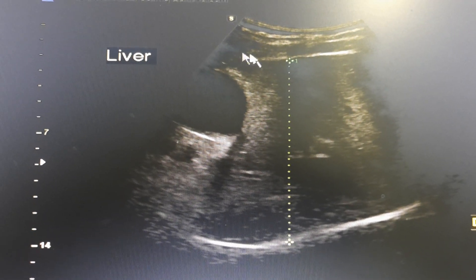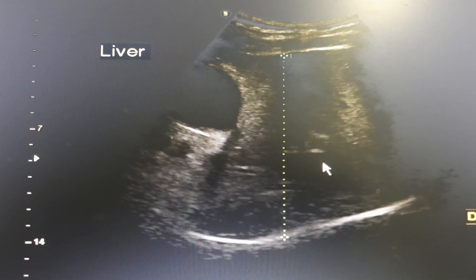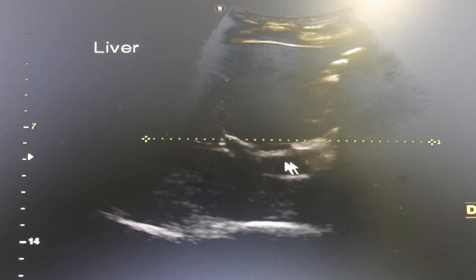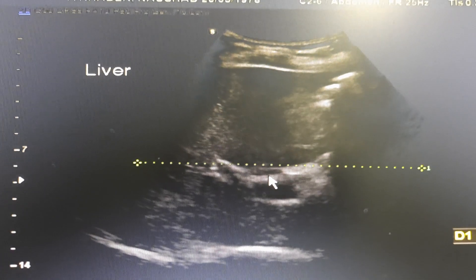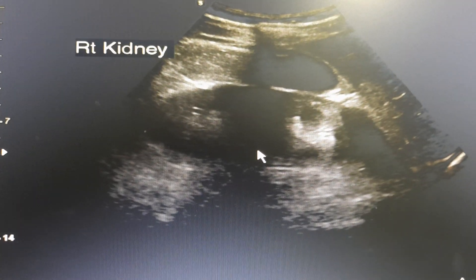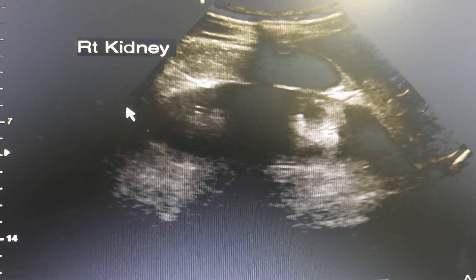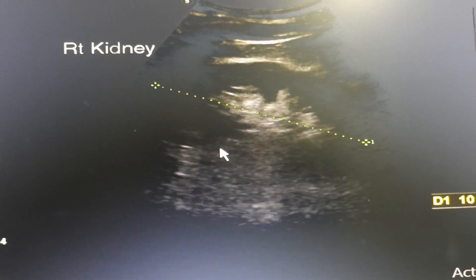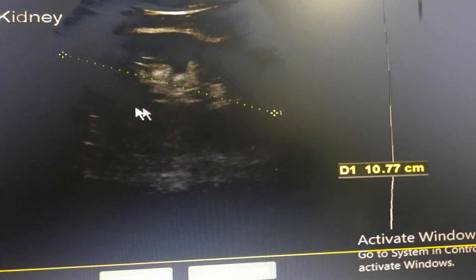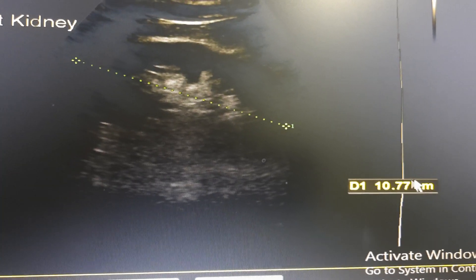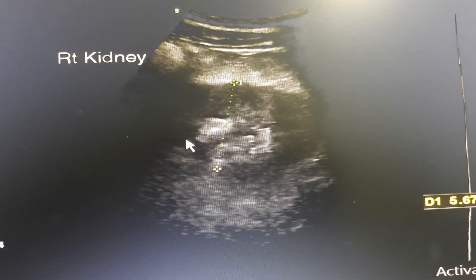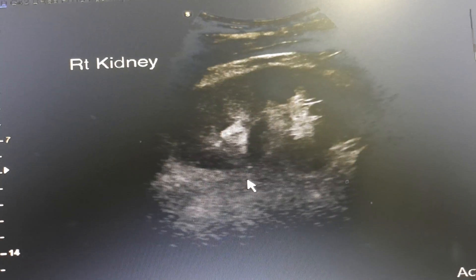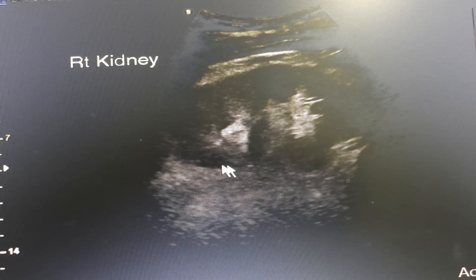We go back to the liver and the transverse measurement of the liver. Then this is the right kidney, which looks good. This is the longitudinal measurement.